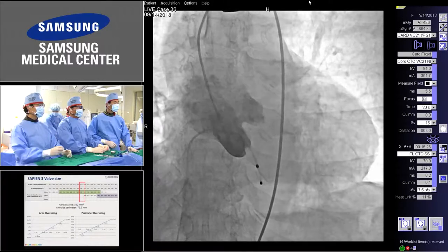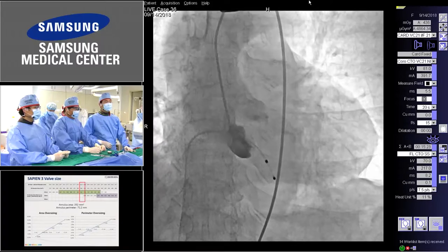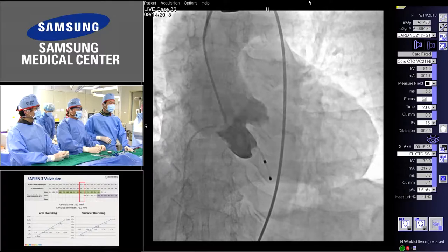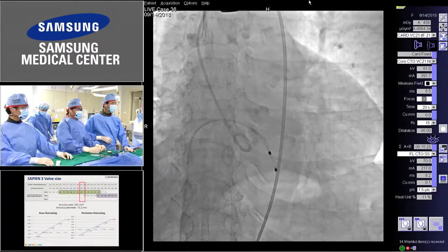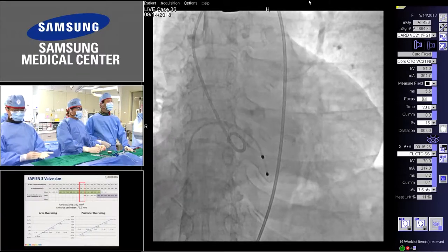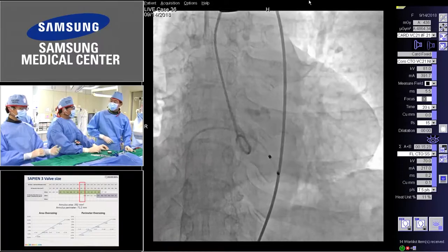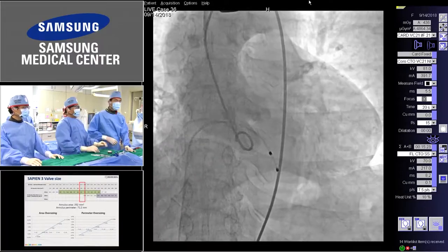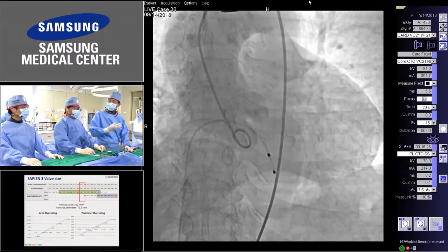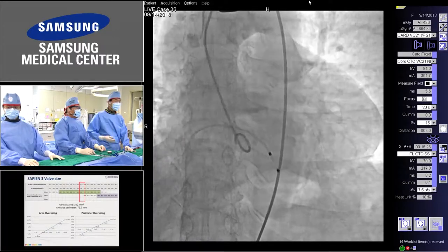So Dr. Gwon, are you using a balloon at all? Yeah, I think the calcifications are not so severe, so I'd better avoid ballooning. Do you recommend ballooning for this patient? No, I'm just wondering about sizing, that's why. Oh, yeah, sizing. Balloon sizing is another issue I'd like to learn: when you put in the balloon, whether there is a leak or no leak is the indication of the sizing of the valve. I was not sure. I'm still learning about that.